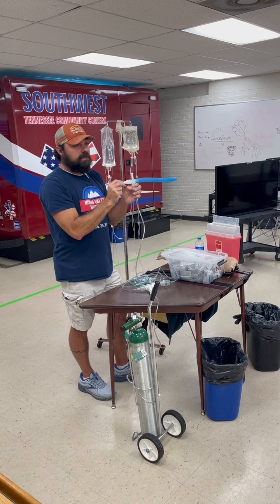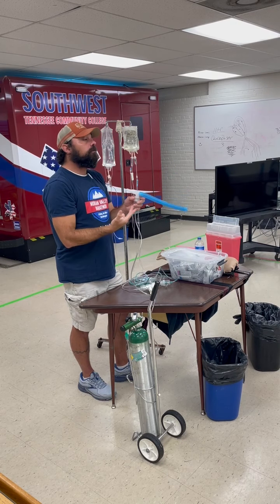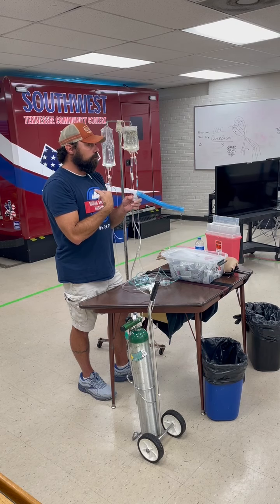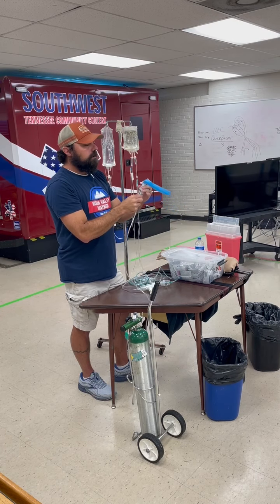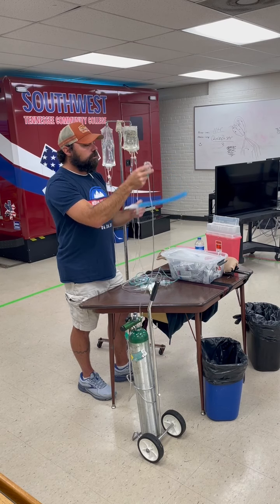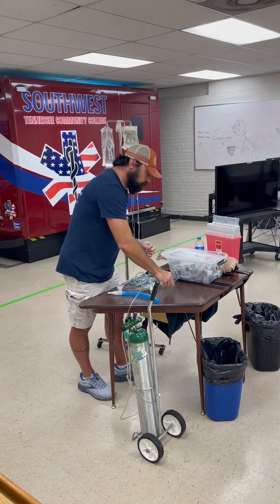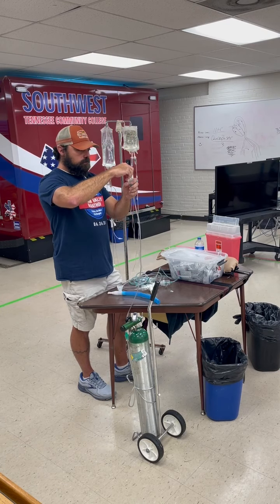Remember, I think I said this last week. You don't instruct them to take a deep breath in and hold it. Tell them to breathe normally in through their mouth. In through their mouth. Okay? And they're just going to breathe until all of this is taken. It simply unscrews, put the medicine in the bottle. Like so.